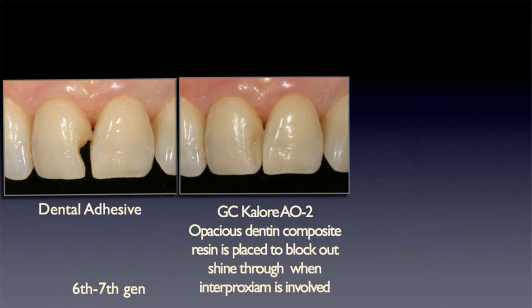Here's Genio Bond. I use this also. You know, G-Bond and Genio Bond, they're all very nice products. And once again, with these all-in-one 7th generation adhesives, be sure you blast that air before you do your final cure.